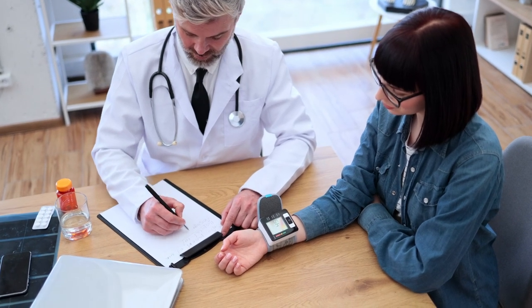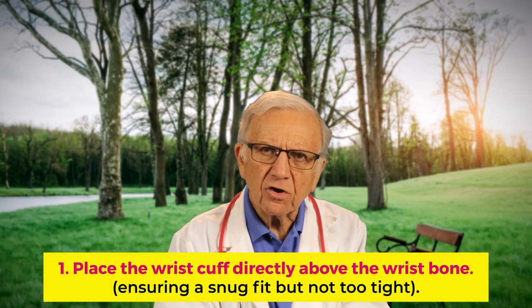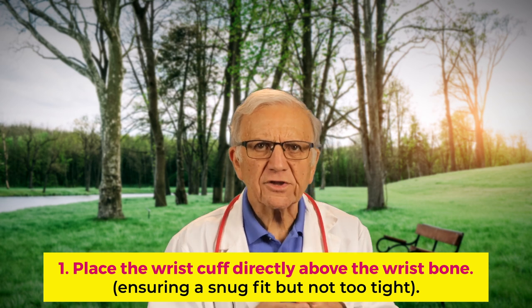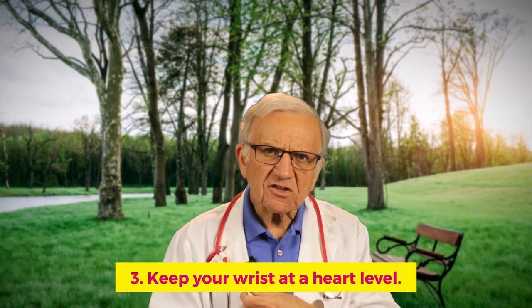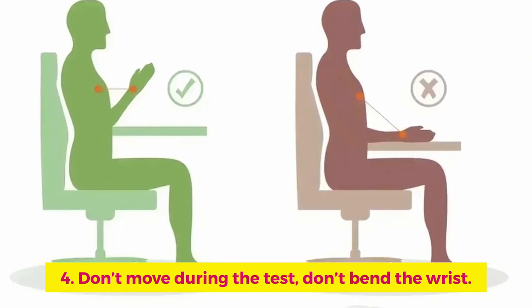Dangling legs or an unsupported back can raise your blood pressure up to six millimeters of mercury. Sit with your bare arm supported on the table, with the wrist at heart level — holding your arm in an unsupported position can add five millimeters to your systolic blood pressure. Keep your legs uncrossed; crossing your legs or even your ankles will restrict blood flow and can raise your systolic blood pressure between two and fifteen millimeters of mercury. Place the wrist cuff directly above the wrist bone, ensuring a snug but not too tight fit, and don't place it over clothes. Keep your wrist at heart level, don't move during the test, and don't bend or flex your wrist, as that will cause incorrect readings.